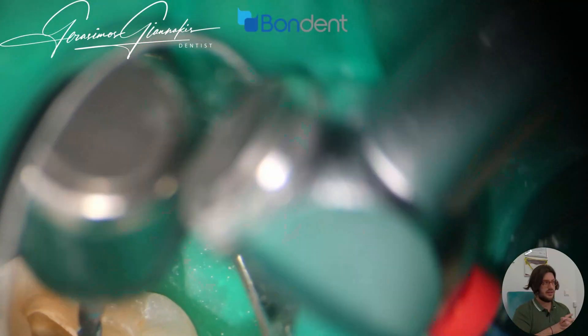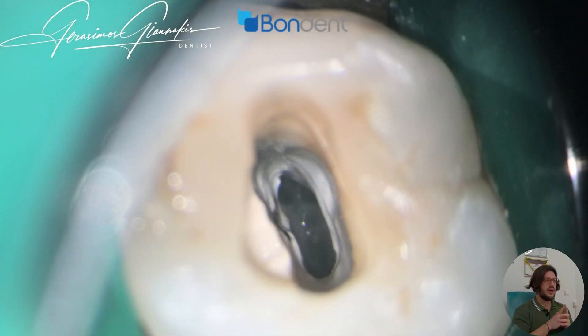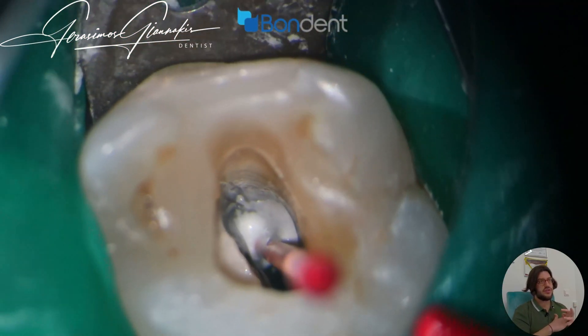The palatal canal in this case was quite easier. As you can see now in the photograph, the two buccal canals are really close to each other, and in that way it is easy for us to miss one of them.